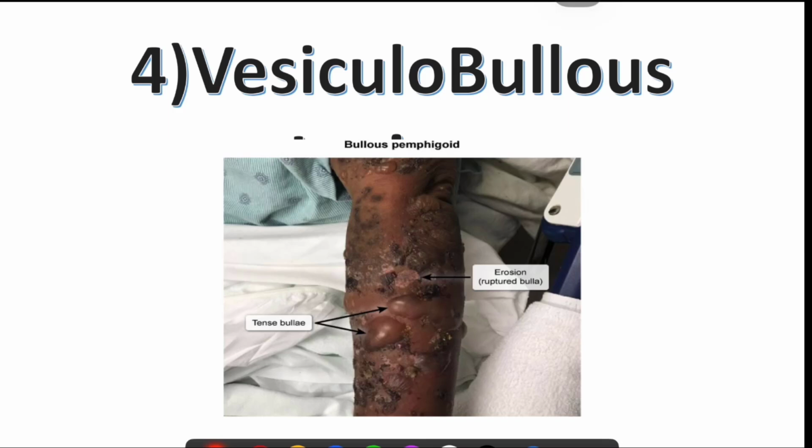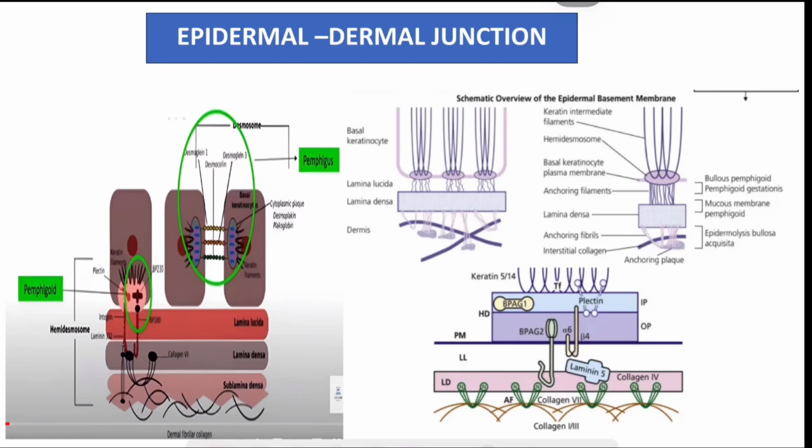So important is, when we are receiving the biopsy, we must know whether we are getting the biopsy from an intact bulla or some ruptured bulla area, because this will give different types of microscopic features according to the time period of the bullous lesion. So it is a must to know about the bullous area.